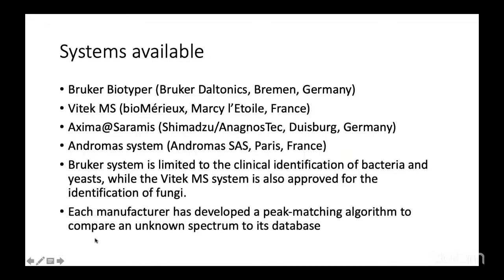Now, what is the problem here in MALDI as well as in Vitek? It will only give you an identification to species level. For example, the problem comes with Salmonella. It will only tell you that it is Salmonella enterica and not go any further, whereas you require whether it is typhi or paratyphi, for which you will need serotyping. The other issue, for both Vitek and MALDI, is the close association of Shigella with Citrobacter, Enterobacter, other organisms, and with E. coli. There are certain difficulties in identifying Shigella in these two systems.